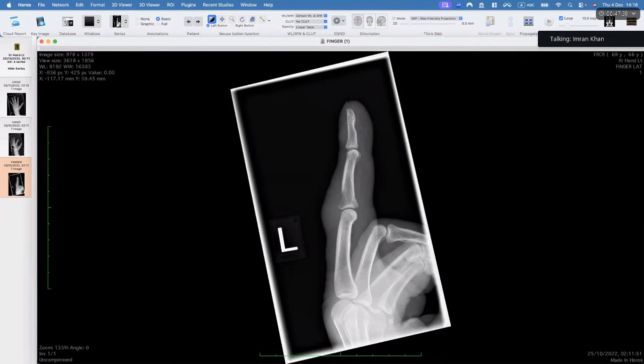Okay. All right. Let's dissect what you've said. First you said the bones appear normal. Do you think the bones appear normal? Just yes or no? No. The bones don't appear normal. Okay, we agree on that. Then you said the appearances of the bone are chronic. So what would be the features of chronic?